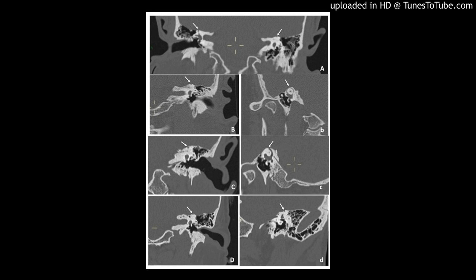The superior semicircular canal should ideally be obliterated in 2 sites, one anteriorly and one posteriorly, to ensure complete obliteration of the canal. Obliterating only on one site can, in theory, cause abnormal perilymph flow and dizziness, although such technique has never been used by the authors.